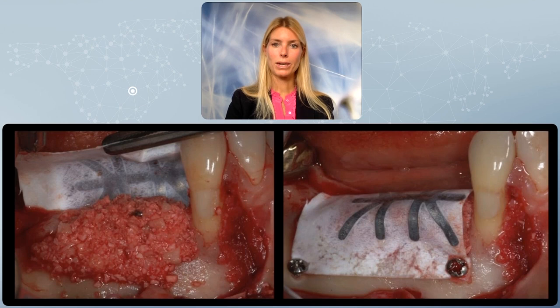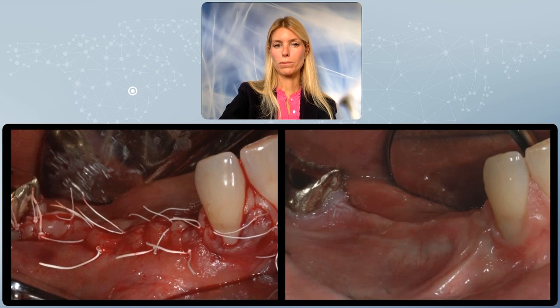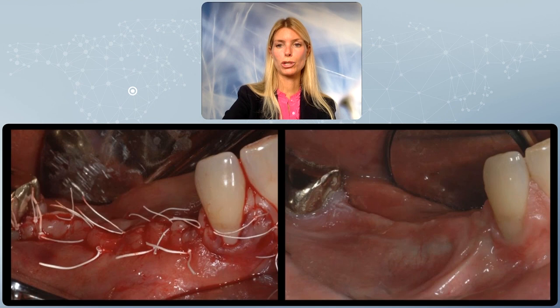As usual, the membrane is positioned on the lingual aspect first to create the wall that is missing, and not vice versa, because it would be extremely hard to position it first on the buccal due to vision problems. So it is always positioned on the lingual, and the membrane is nicely pulled and secured by small screws to avoid any movement whatsoever. The suture is always the same, with a horizontal mattress suture and single interrupted sutures on top, to have exactly two different layers of suturing, the most internal portions and the most coronal portion of the flap itself.